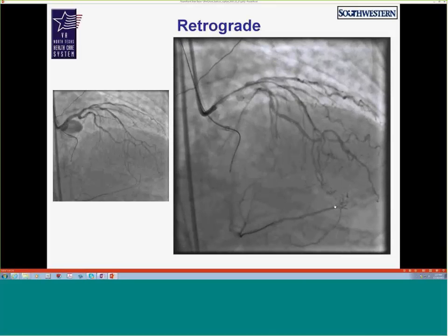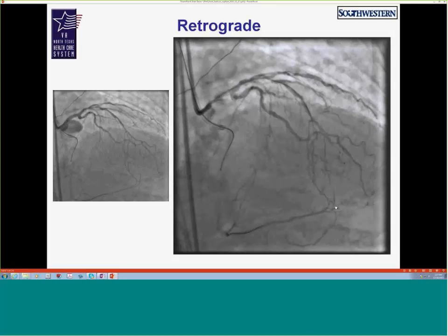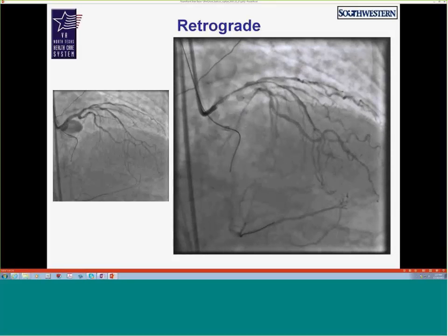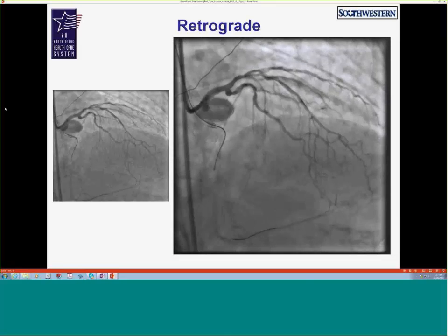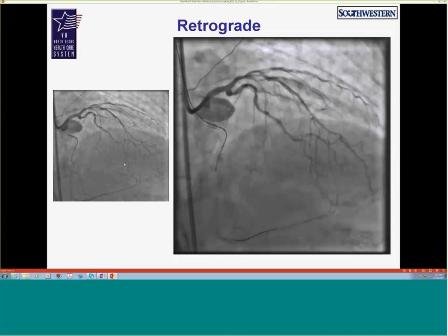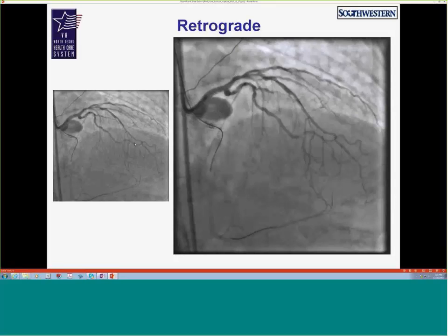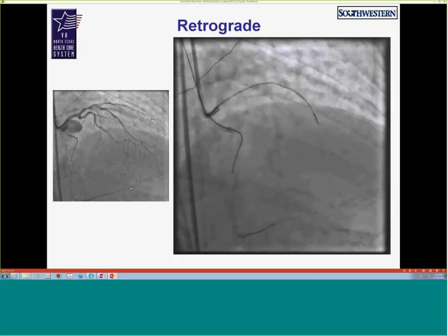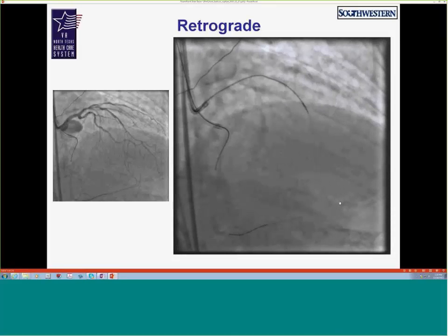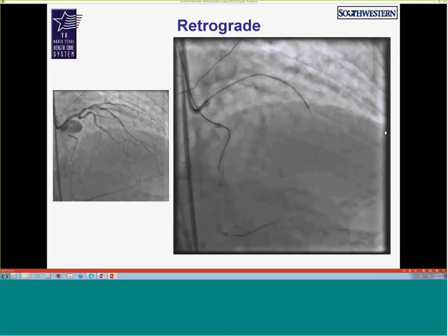And you see pretty decent collaterals. Interestingly enough, I think our wire is actually not in a good collateral. Can people see the movie? It may not be most clear, but yeah. So we're able to get through, and as you see, there's a bunch of collaterals, CC1 meaning connection all the way down, and some CC2s as well, so nice, more than 0.4 millimeters. And interestingly enough, when we went with the wire, I think we got through a smaller one, not the bigger ones we thought would be the successful one.